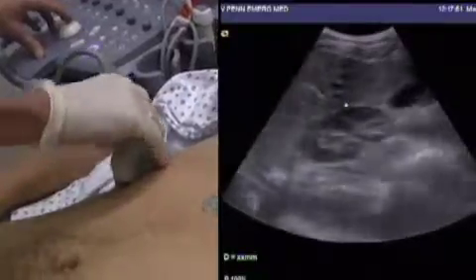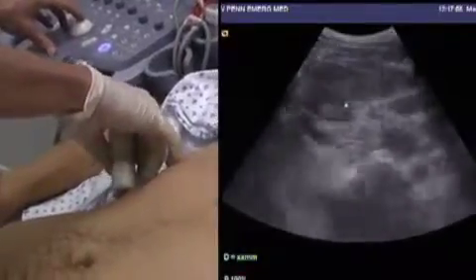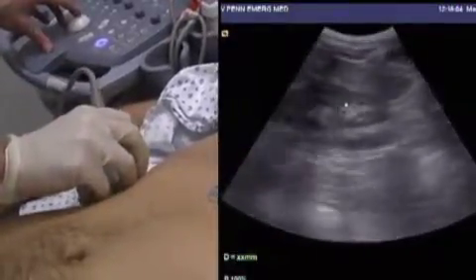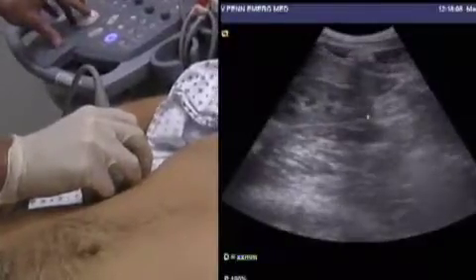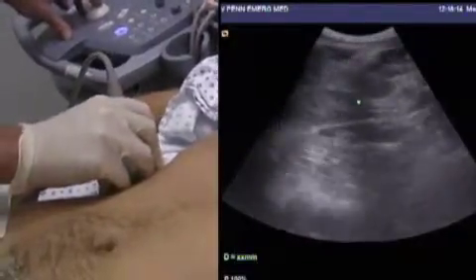One can also scan transversely if having a problem — here's a transverse view of the kidney — and scan from top to bottom and back up to the top using a single rib space. Going back into the longitudinal view of the kidney, in this model the inferior pole of the kidney is very clearly seen, and scanning through it can be easily done from the same location.